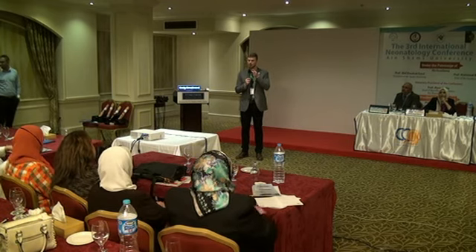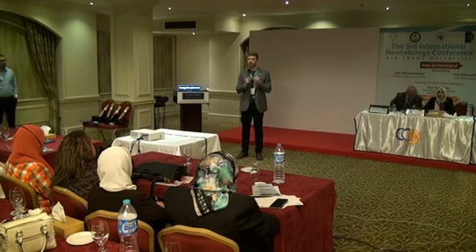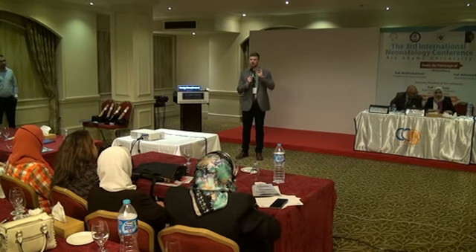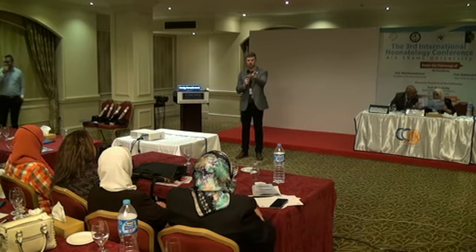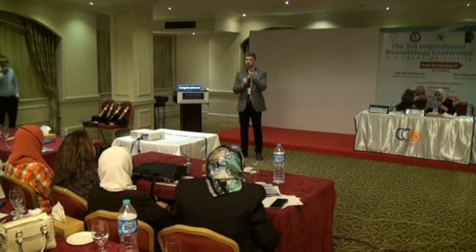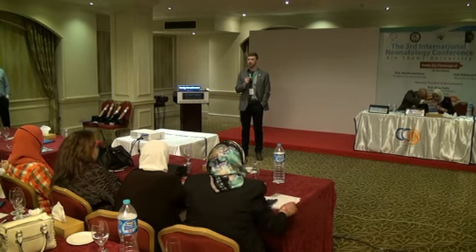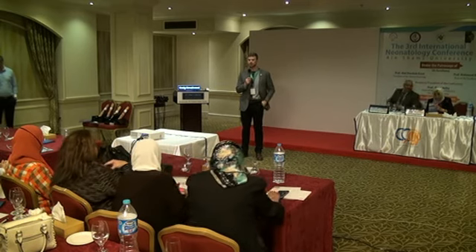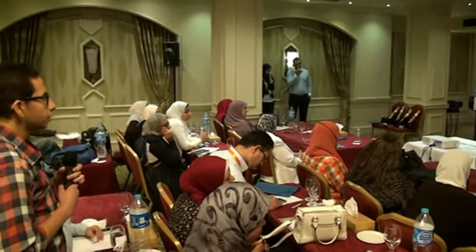The dead space is okay, so long as it's been completely flushed and has a reduced capacity of CO2 in there. But I think the other point you're saying is because it's not necessarily completely pulled out of the subject, you're going to have a little bit of CO2 left in the endotracheal tube, which would be another portion of the dead space. In that case you're right, there would be a little bit of CO2, but at the point where we measure it with the capnograph, in general we like to see those values basically zero, and most of it can get flushed out. So it's there, but it's almost negligible, so it's considered zero. It would be so close to zero that you wouldn't be able to detect it or really care.